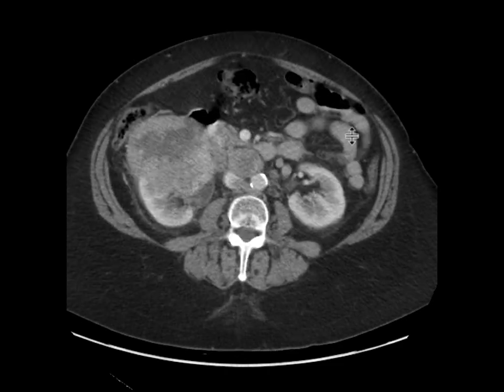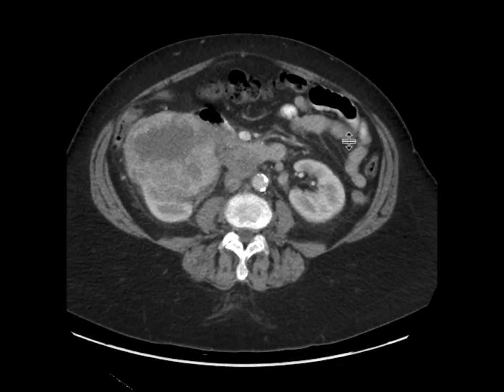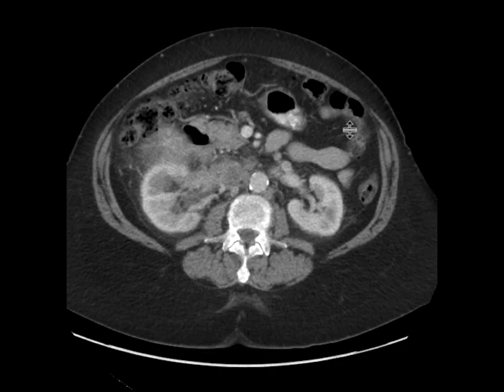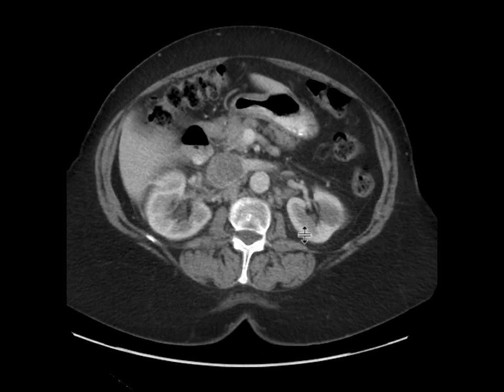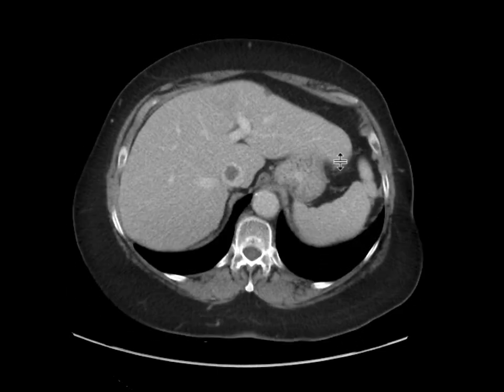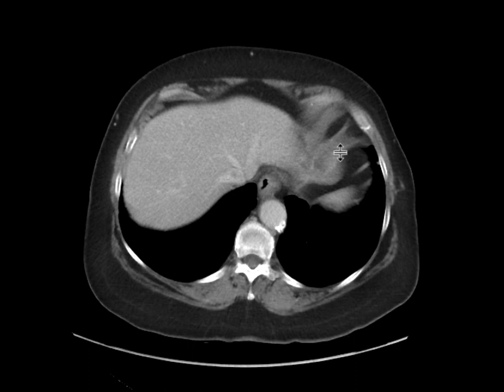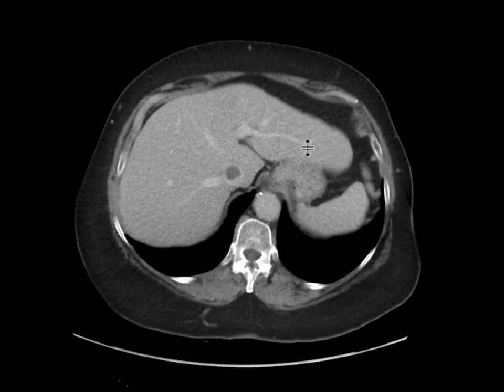The more we look, the more we find. Not only does the patient have renal cell carcinoma, but it's also associated with tumor thrombus within the right renal vein. That tumor thrombus extends to the inferior vena cava, going up cephalad along the inferior vena cava, a ways upwards within the supra-hepatic IVC.